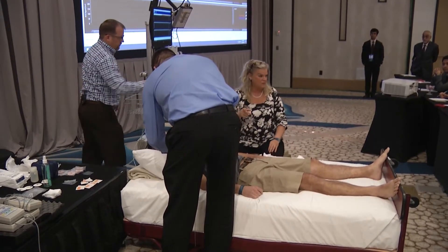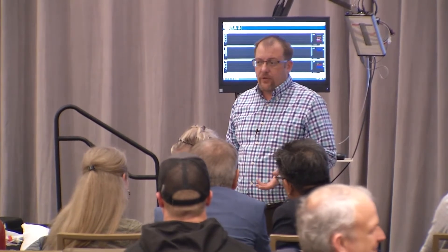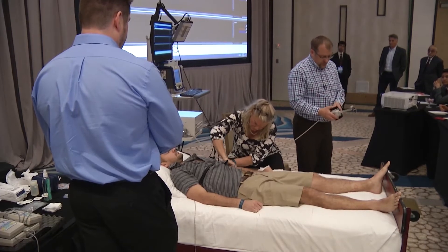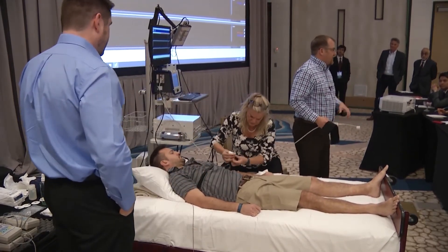He hooks up every patient that goes to our lab and does all the blood pressure. There are numerous beat-to-beat blood pressure devices out there. We're demonstrating the one that comes with this system, but just know that there are other devices as well. They all have their inherent characteristics, so each one has a little bit different troubleshooting. You can get that information from the vendors.